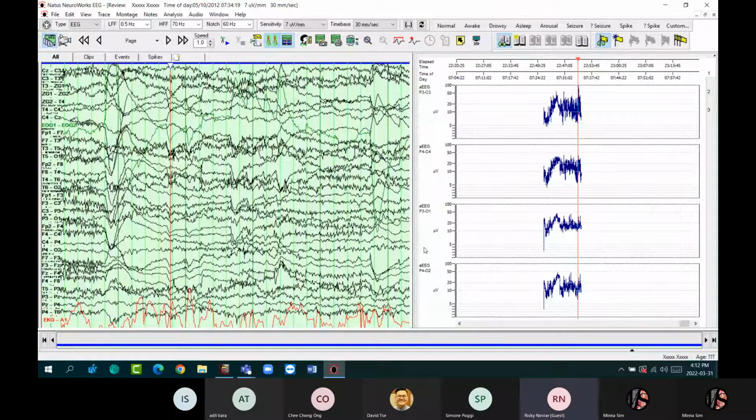Can you maybe make an example from your side? Sorry, I don't quite understand the question. You're asking how to explain to the doctor that this is the trend result? Yeah, that's what I mean.